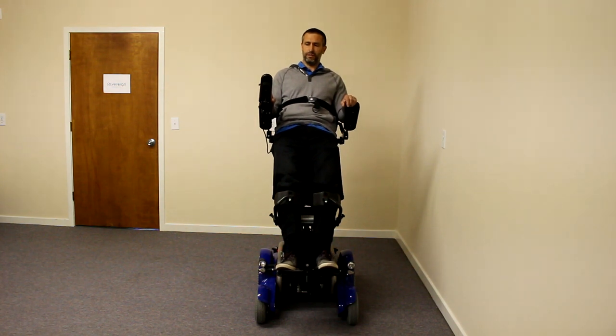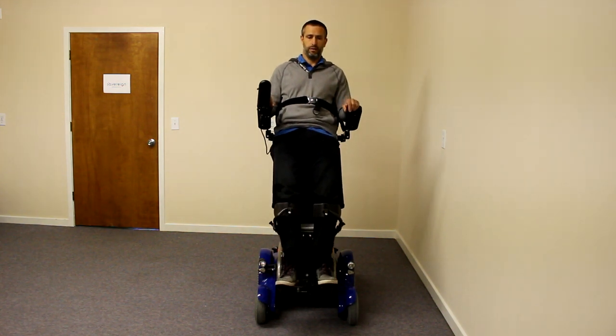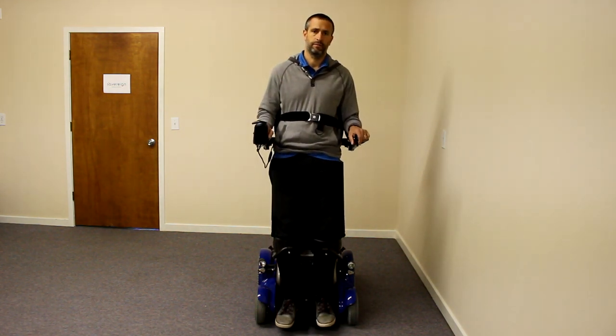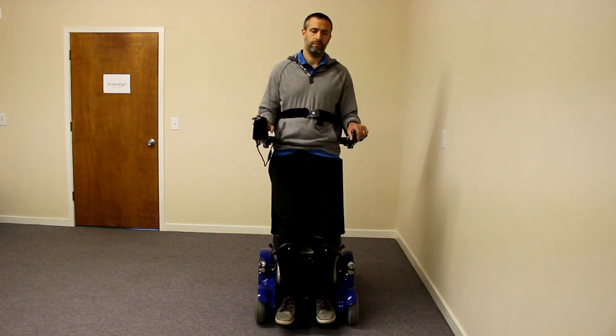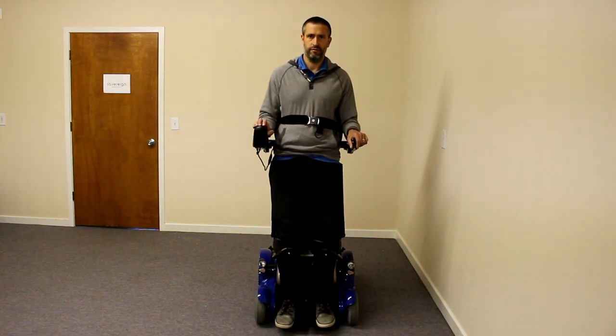From there you can go all the way up into the standing position. Because my tilt is all the way back, I'm pretty high up and tilted back. After you stand, you can still use your tilt-in-space. I can actually tilt back a little bit from here — if I feel fatigue or feel like I'm going to fall forward, I can just tilt myself back, or seat myself again.